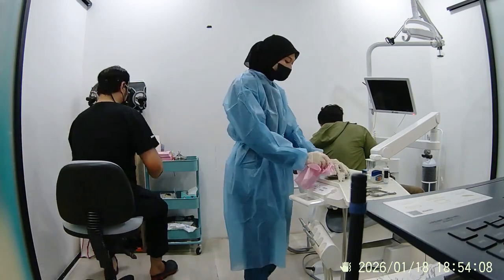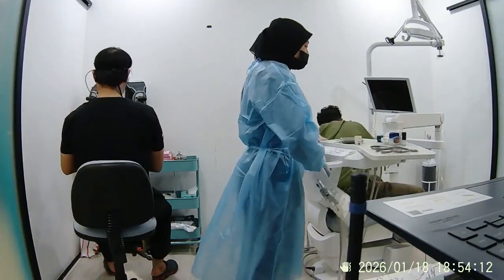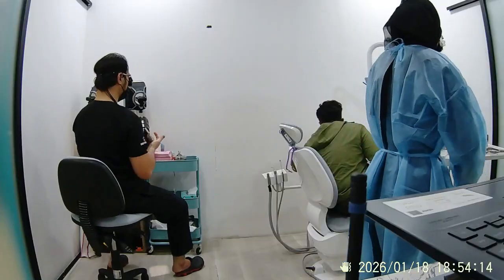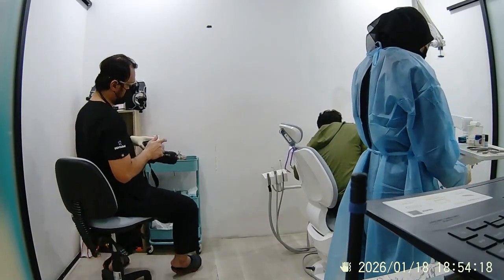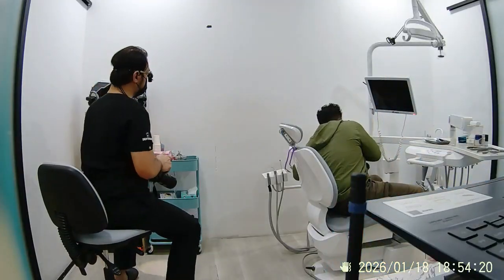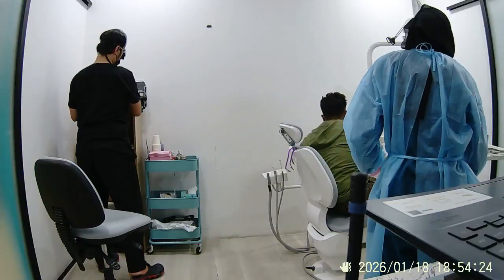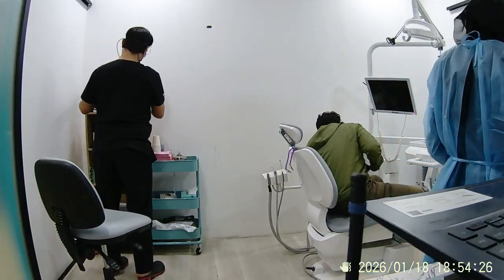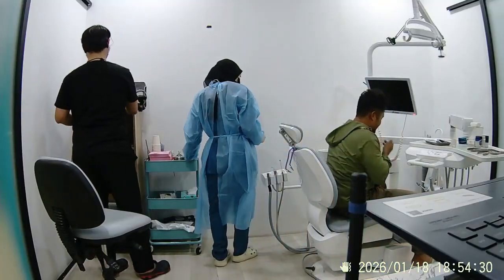So in this video, I'm trying to show and share with you how we go about dental photography and orthodontic consult. But apparently in this video, I've edited out the earlier part of the appointment, just to highlight the photography and the final discussion and consult.